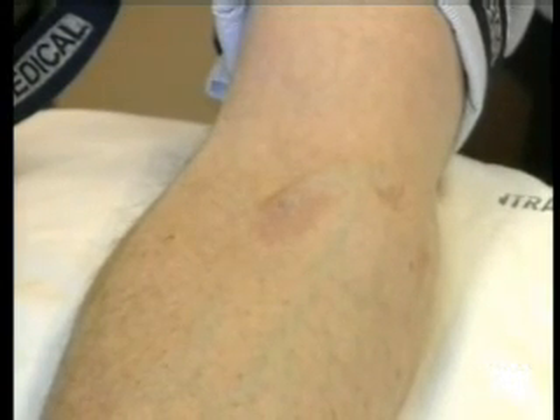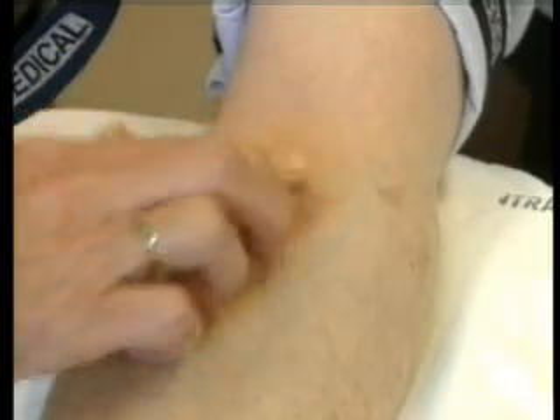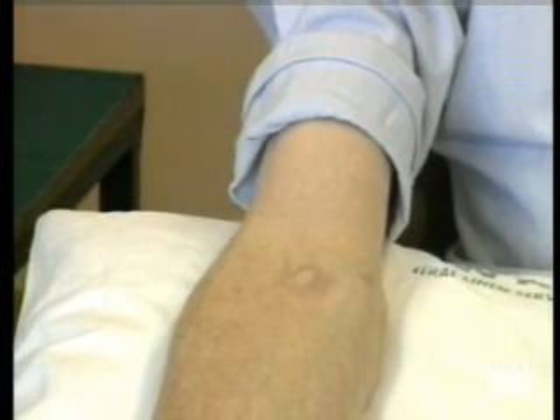The phlebotomist now asks the patient to remove their finger, has a look at the venepuncture site, makes sure it is not oozing, and then applies a small plaster to it. The patient is told that the sample will be sent off to the laboratory and the result will get sent to the doctor in due course.